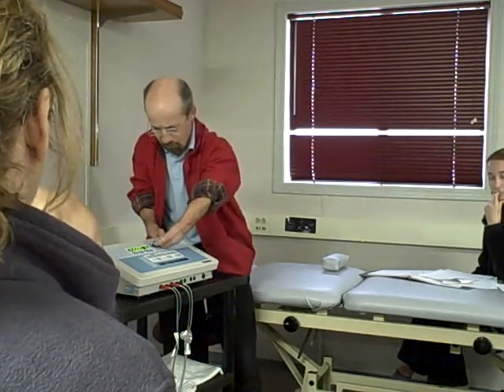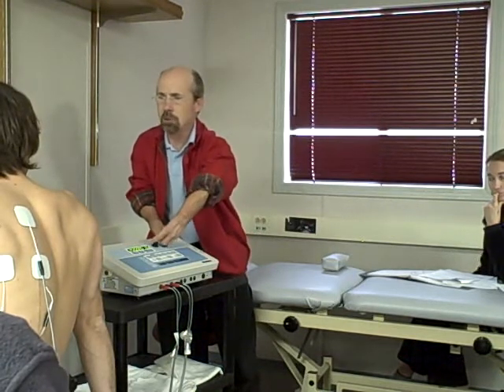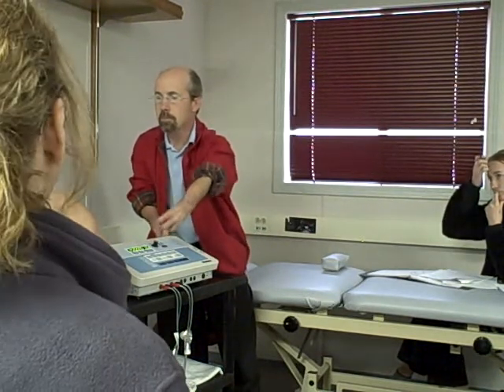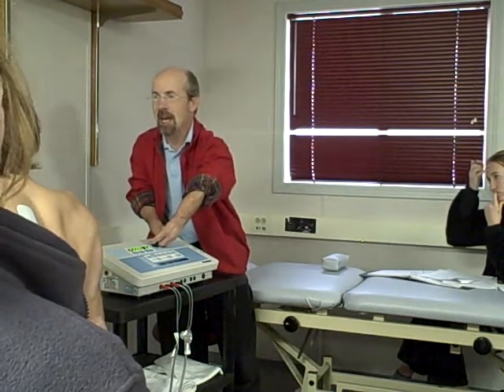What is the unit of the 15 and the 16? Well, every waveform's different. This is for cycles per second. Let's not get too deep. How you feel it move from area to area, that's the most popular parameter, where it's scanning. You can change that a little bit, but that's pretty common with quadripolar interferential.